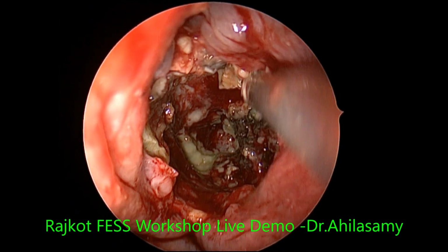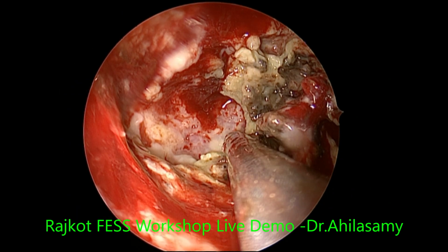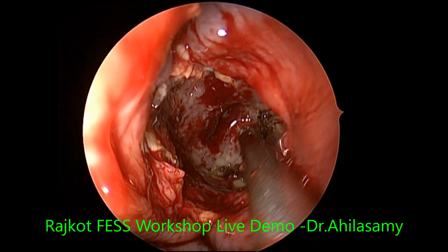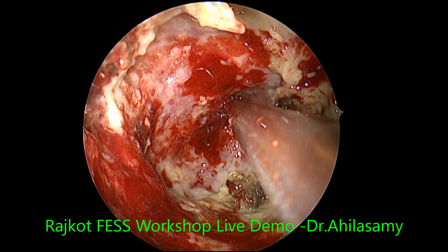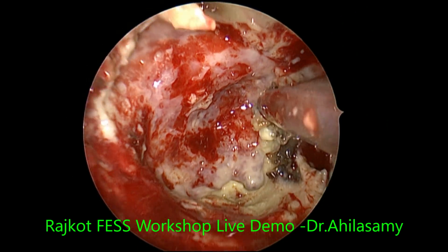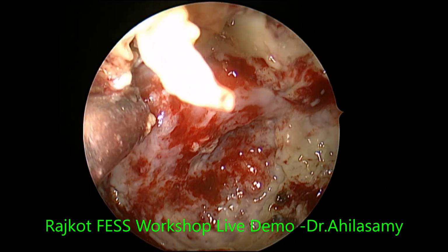See, there are no questions, nothing. Are they sleeping? Are they bored with my surgery? I don't know what's happening there. All right, sir. Eagerly watching today. Yes, eagerly. First time watching a live surgery under LA. Do you want me to open and show? Under local. Yes, they want to. So set the drill. All will send you video after operating under local, sir. All are saying like that.